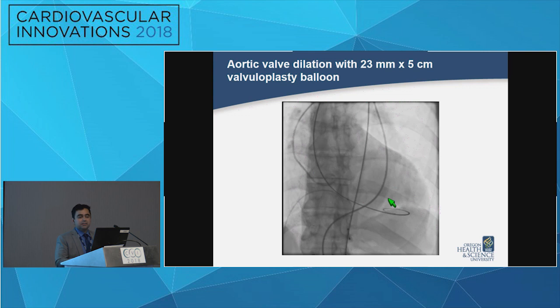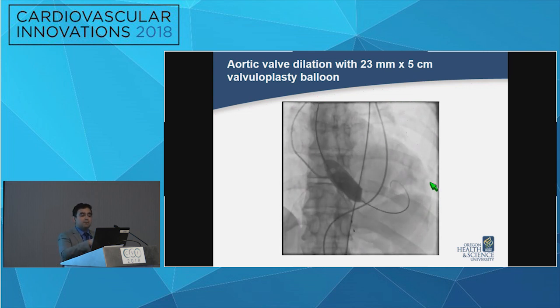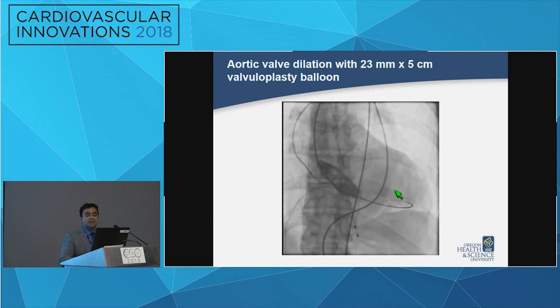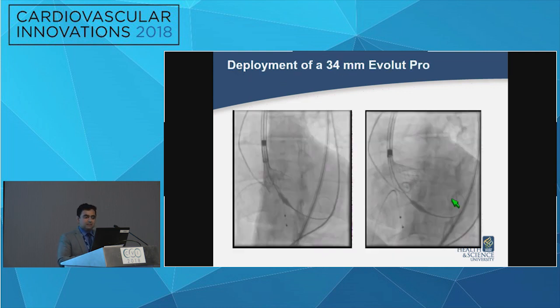So we performed valvuloplasty with a balloon, and you'll note the wire position. We intentionally avoided putting it in the apex to avoid disrupting that thrombus. I didn't see a sentinel device. So we actually didn't have Sentinel at that time.